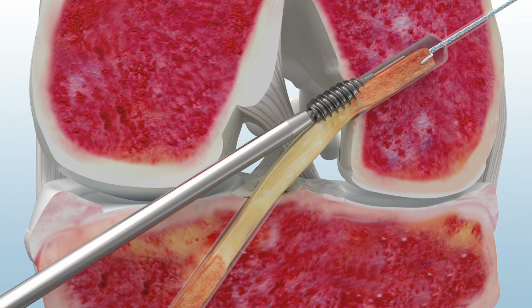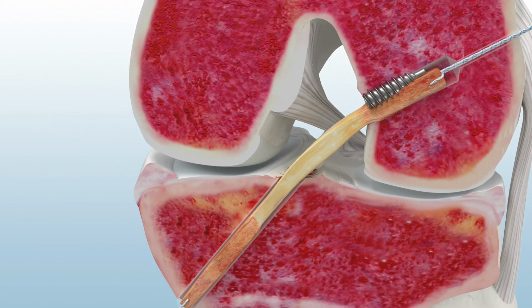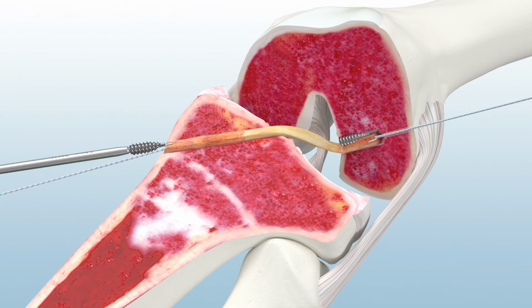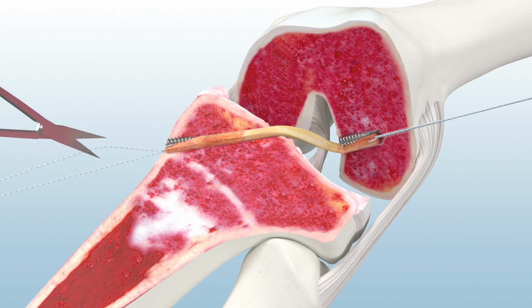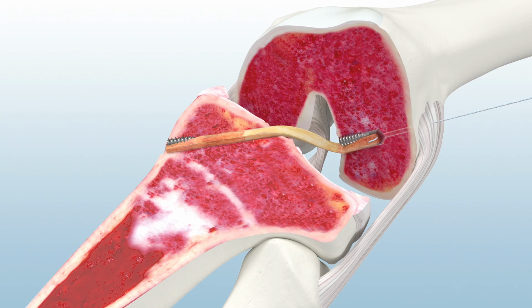Rotate the driver clockwise until the self-tapping threads engage bone and advance the screw forward until flush with the tunnel walls. Then, place the leg in extension and repeat the Easy Start insertion process to complete tibial fixation. Finally, remove the passing sutures and close to complete the ACL reconstruction.